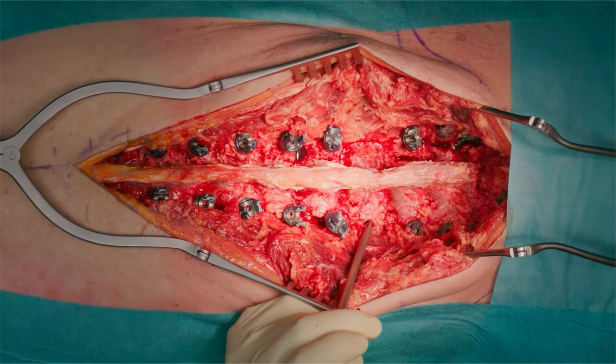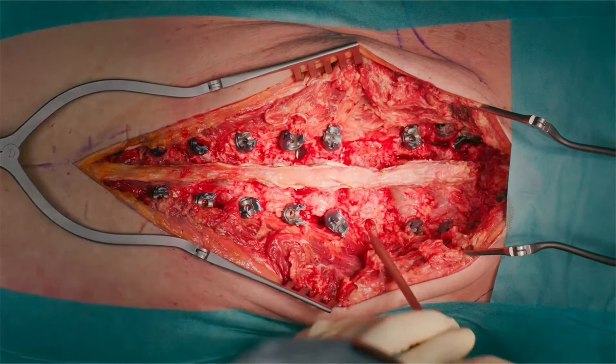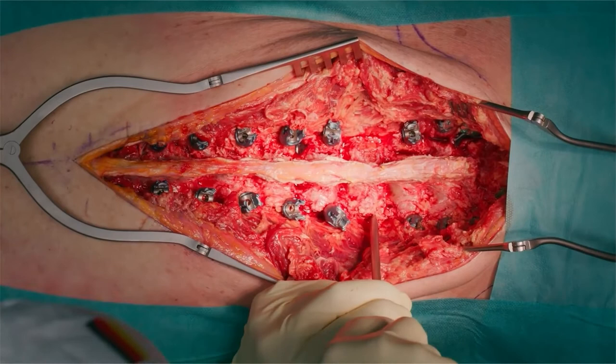If we now take a knife — when you do real surgery, do you open the muscles as far? No, this is just for the demonstration of the transverse process. So how do you orientate yourself when you perform surgery? I do this maneuver — I feel the top and bottom part of the transverse process, take the midline, and go in here.